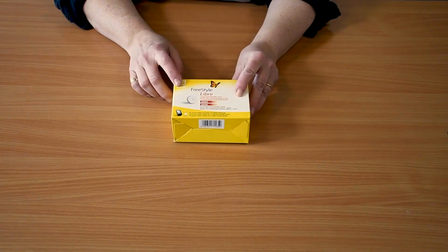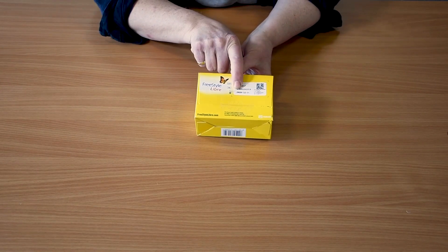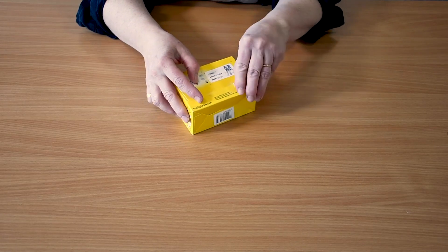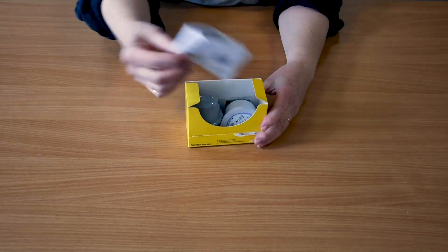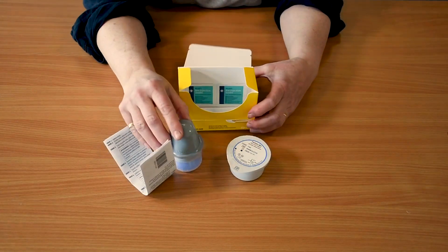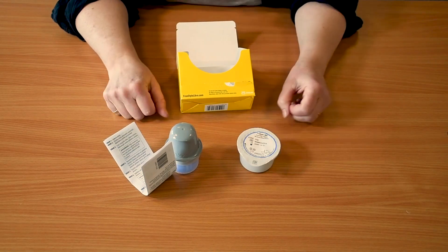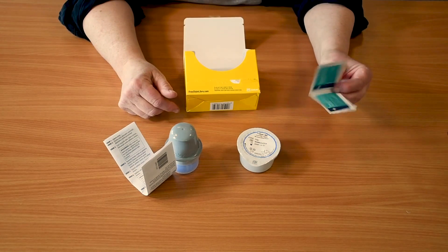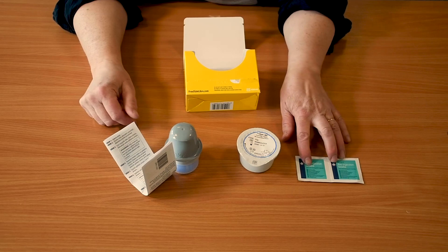In the other box you will find the sensor and the applicator. It is important that you check the expiry date to make sure it is still in date — you will receive two of these on prescription. Inside the box you will also find wipes, which you may want to use especially if you have applied cream, just had a shower, or your skin may be a bit soapy.